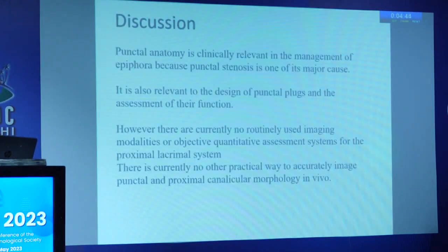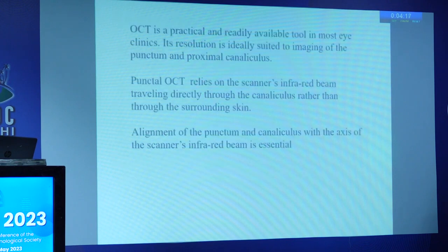Punctal anatomy is clinically relevant in the management of epiphora because punctal stenosis is one of its major causes. It is also relevant to the design of punctal plugs and assessment of their function. However, there are currently no routinely used imaging modalities or objective quantitative assessment system for the proximal lacrimal system. There is currently no other practical way to accurately image the punctal and proximal canalicular morphology in vivo.